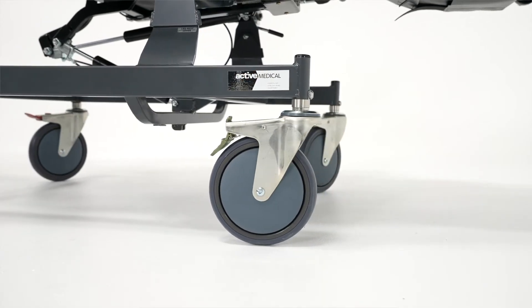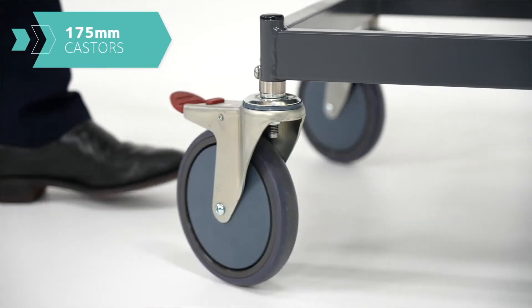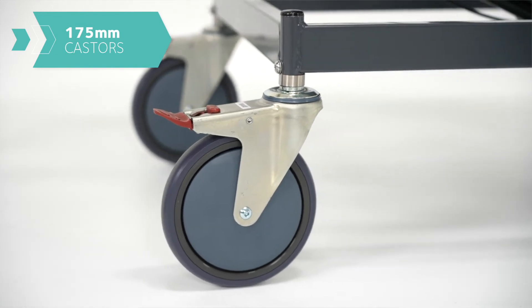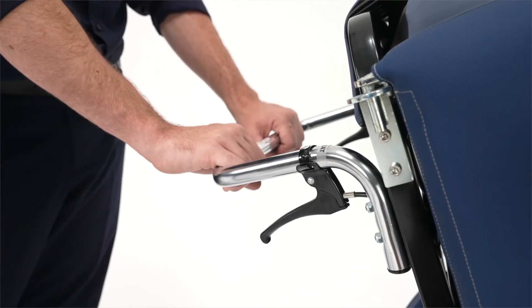The Regency has two front directional lock casters and two rear locking casters. All the wheels on the Regency are 175 millimetres to reduce the overall effort required to move the chair. The chair has a horizontal push handle which is located at the top of the backrest.